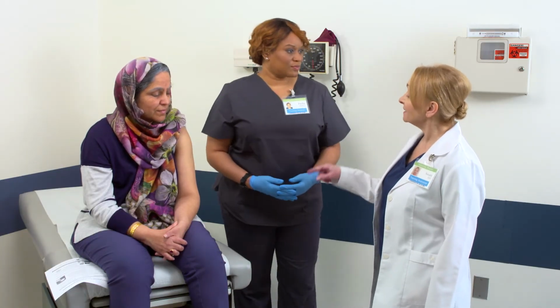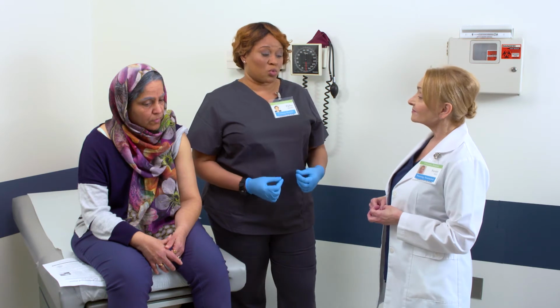Pasha, what length needle are you using and why? The patient is an adult with a medium build, and we're using the deltoid muscle. In general, the needle is 5/8 to 1.5 inches long. The needle choice is based on the specific patient, with the goal being to ensure reaching the muscle, but not bone. IM needles are typically between 20 and 25 gauge for aqueous solutions and biologic agents, based on the medication, the site, and the patient. For this patient, receiving a vaccine in the deltoid, I'm going to use a 22 gauge 1-inch needle.